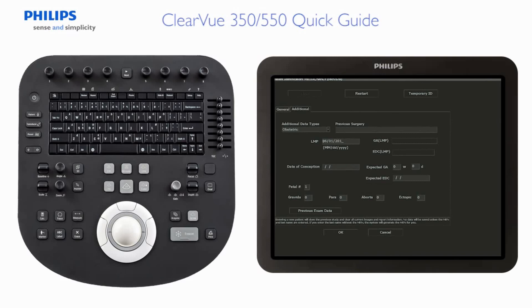When using an obstetrics preset, a trending graph can be generated for the current study, for studies saved on your system, and for studies saved to removable media. Trending data is dependent on entering a last menstrual period date, or a date of conception, or an estimated date of confinement.